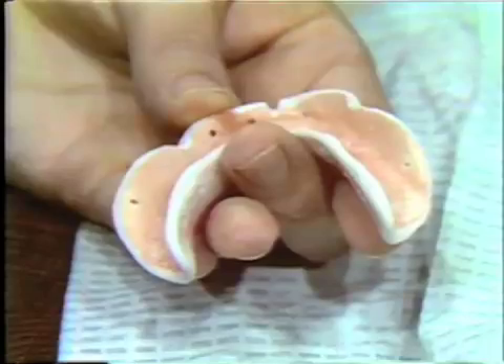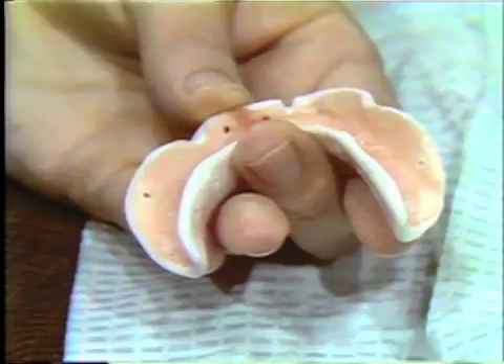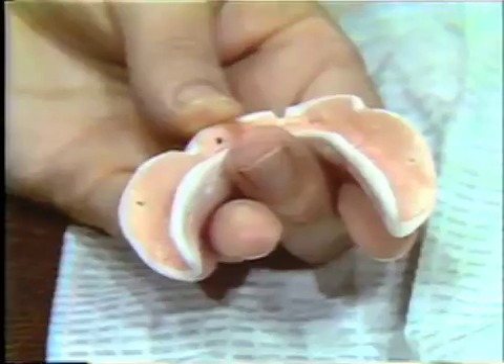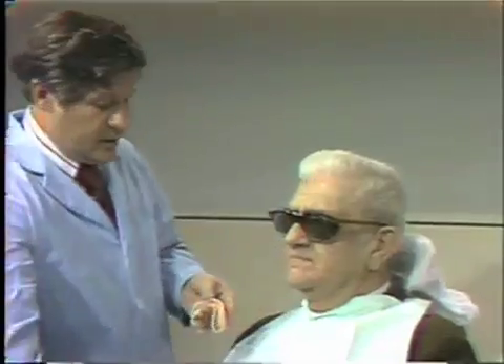All too often we are too quick to begin to border mold this area and make compound additions without first checking in the patient's mouth to see whether or not additions are even necessary. So the first step in securing the final mandibular impression is to evaluate the tray intra-orally.